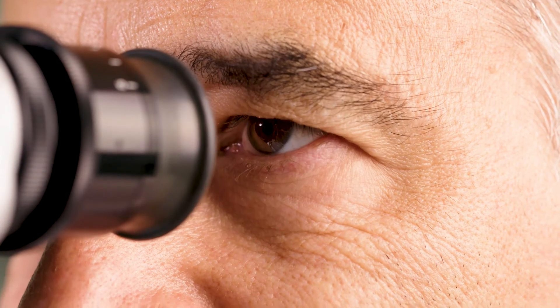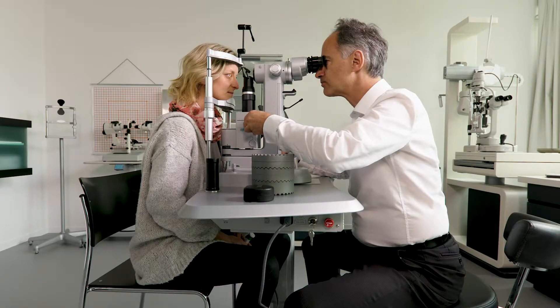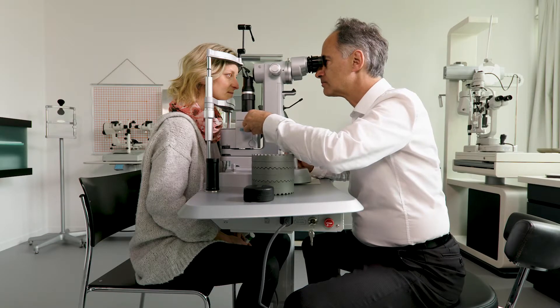We only see the laser spots later in the autofluorescence. This is different from other lasers, such as diode or argon lasers.